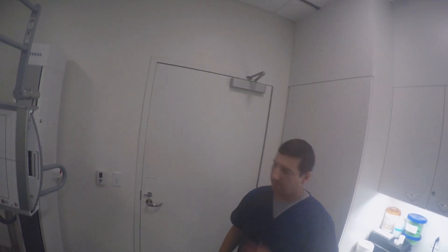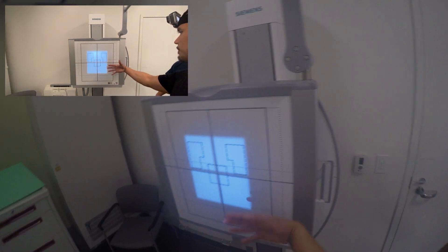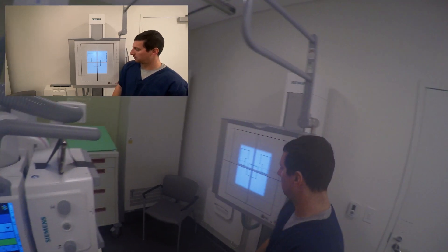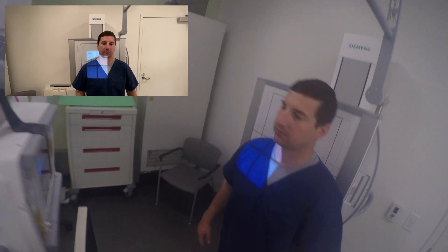All right, so we're looking at your shoulder, correct? Yes. Which side are we looking at? Right shoulder. Okay, that's what we have here. Alright, great. So we're going to have you stand over here. Your right shoulder is going to be in this light field here in that crosshair. Your back is going to be against that board, okay? It's very important to give clear directions to your patient. I've told my patient to put his back against the board and roughly the area where I want him to be. Soon I'll direct him exactly where I want him.